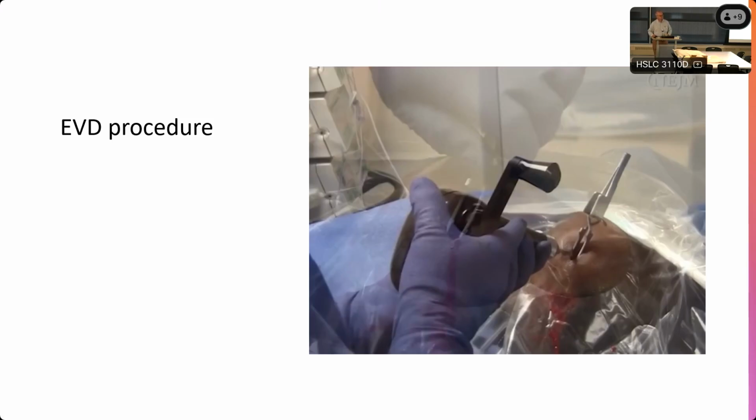But you don't have this, so these are the worst drills ever. Sorry, I've used them like three or four times. These are so bad. You mean the power drill? Yeah, the power drill. They are funneled first, they don't have the same homogeneous thickness throughout. They stop halfway and you think you're through and you're not through.